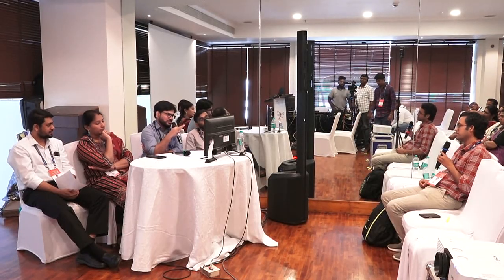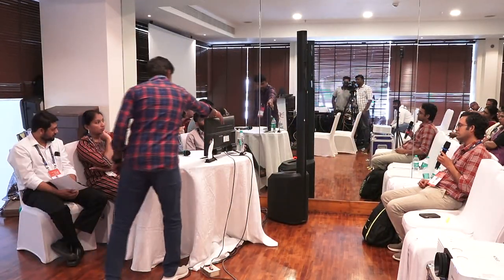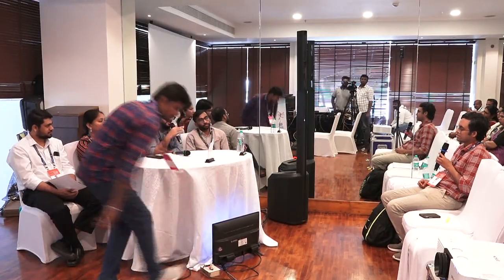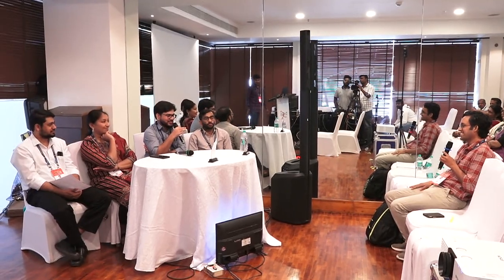Of late, I've been using the Heidelberg Spectralis, which actually measures only the ganglion cell layer. That's the advantage. But I think Zeiss measures the ganglion cell and the inner plexiform layer. Most of the studies have been done based on that only. With Oculus, I'm not aware. It's an old machine, so I'm not sure about that.